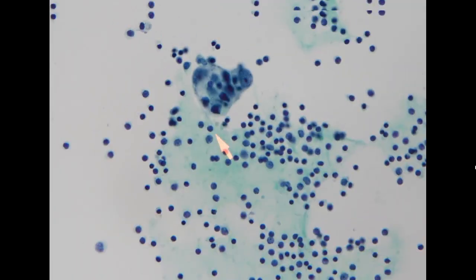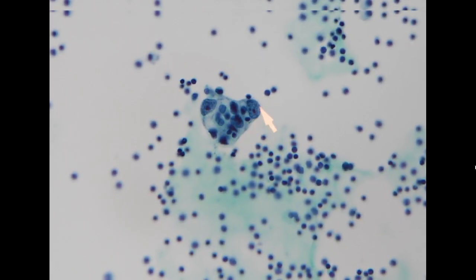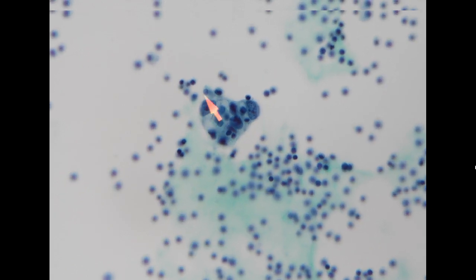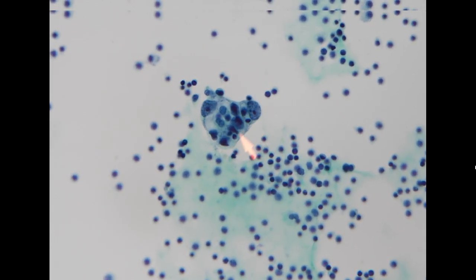We will usually go to higher power to confirm the nuclear features. In this cluster, you can appreciate that we do have a few larger cells with irregular coarse chromatin and prominent nucleoli. The shape of the nuclei are all very different. This is triangular, this is oval with a little bit of irregularity over here, and they are in a tight cluster with some lymphocytic infiltration. So this is consistent with metastatic adenocarcinoma.